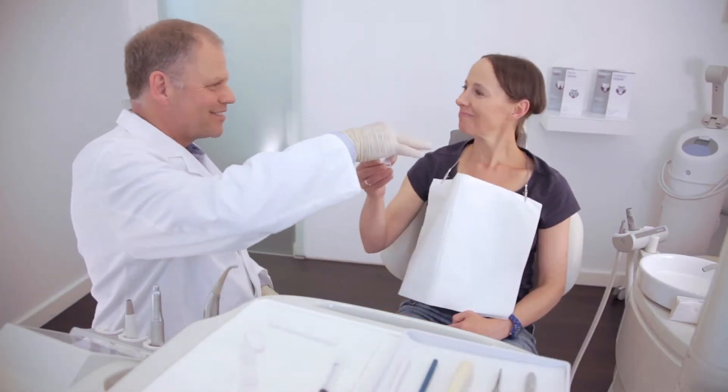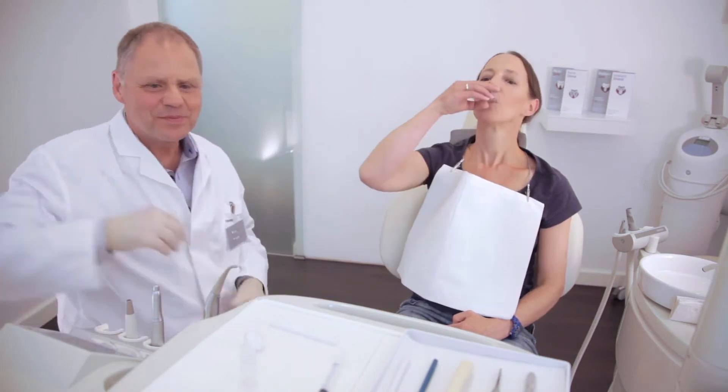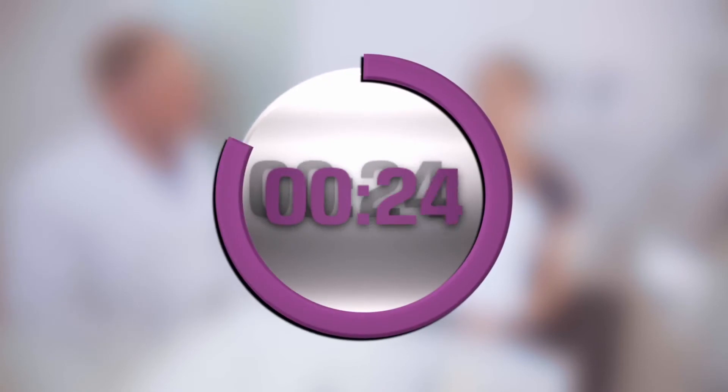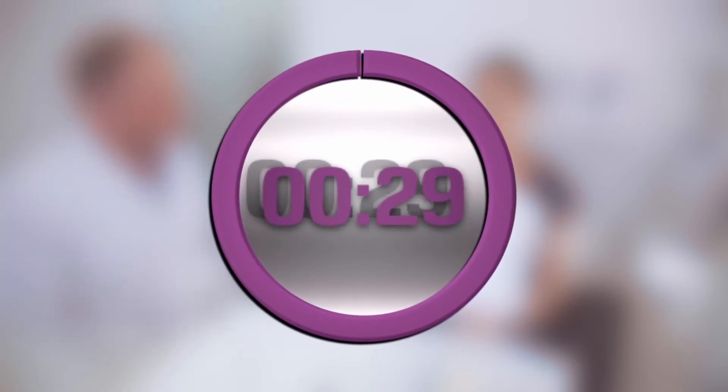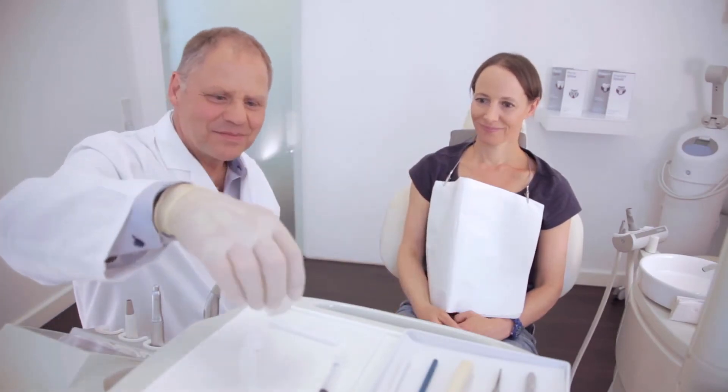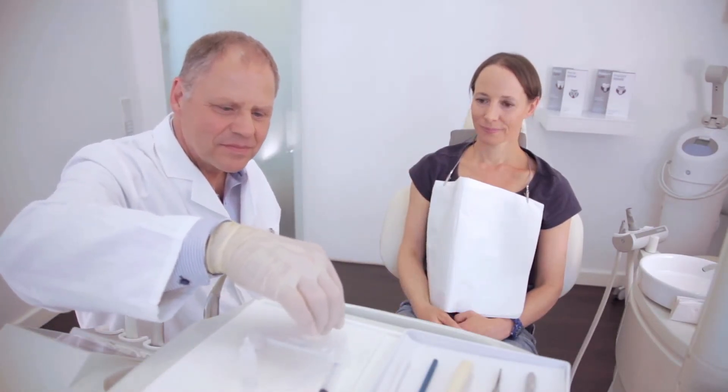After one minute has passed, have the patient rinse with the sterile water provided for 30 seconds. After 30 seconds have passed, have the patient spit back into the small cup provided.